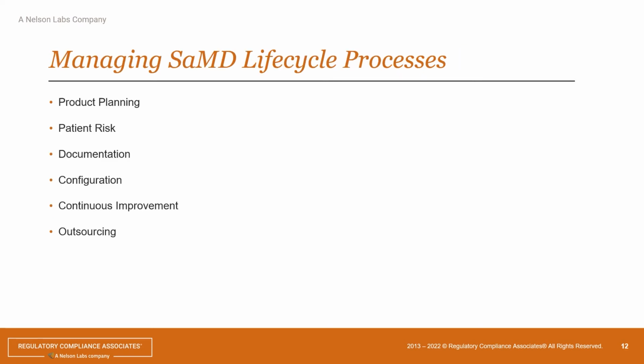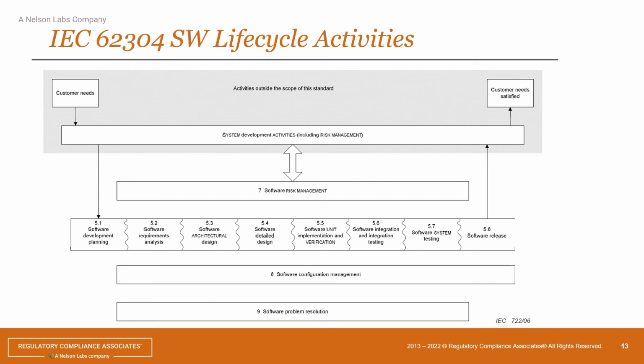So managing SaMD, so this is like when you are doing product planning for your design and development. It's about patient risk, documentation, and software configuration, and then how do you do continuous improvements, and then software. Since you could parcel out pieces, then there's an opportunity for outsourcing, and you need to have processes in place to deal with that outsourcing piece. So here's the lifecycle activities with 62304.